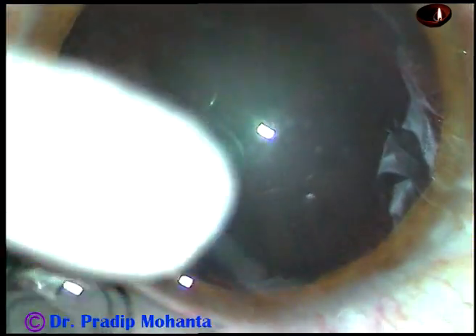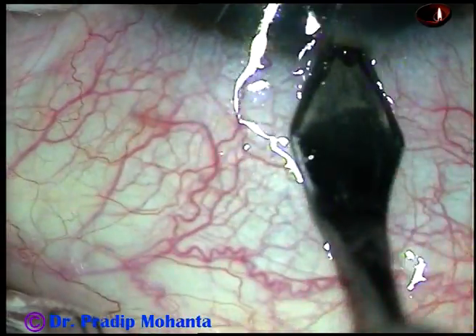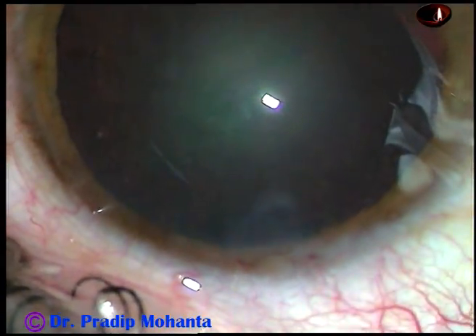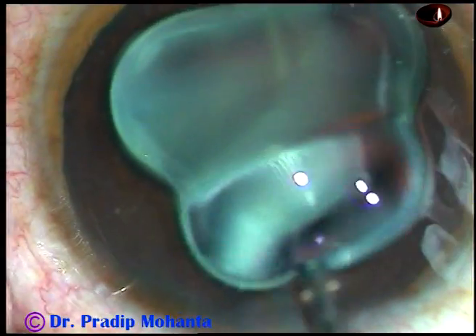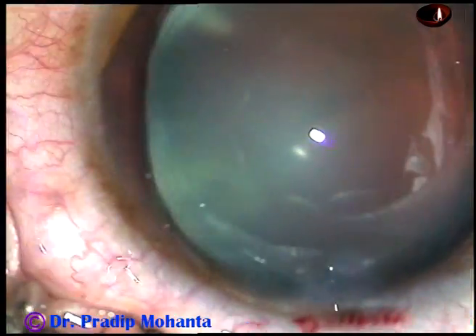Friends, this is a very soft cataract. Let us see how it was managed. This is the main incision, a 2.8 mm incision on the posterior aspect of the limbus. And now, visco is injected into the anterior chamber and it is sprayed over the corneal epithelium for better visibility.